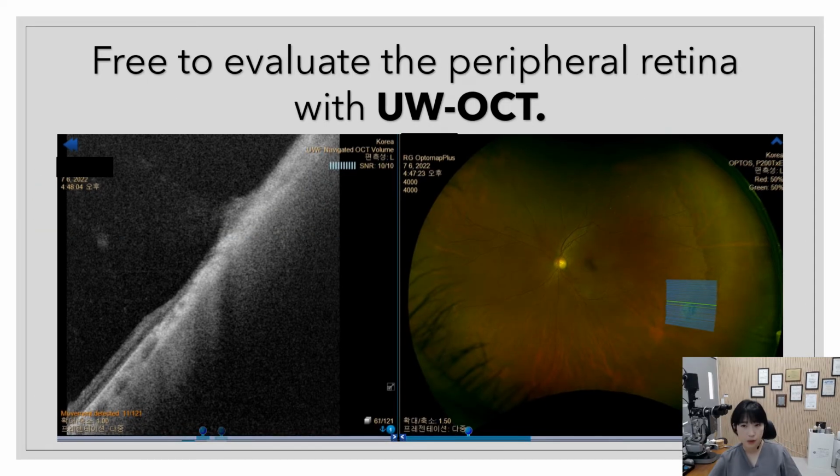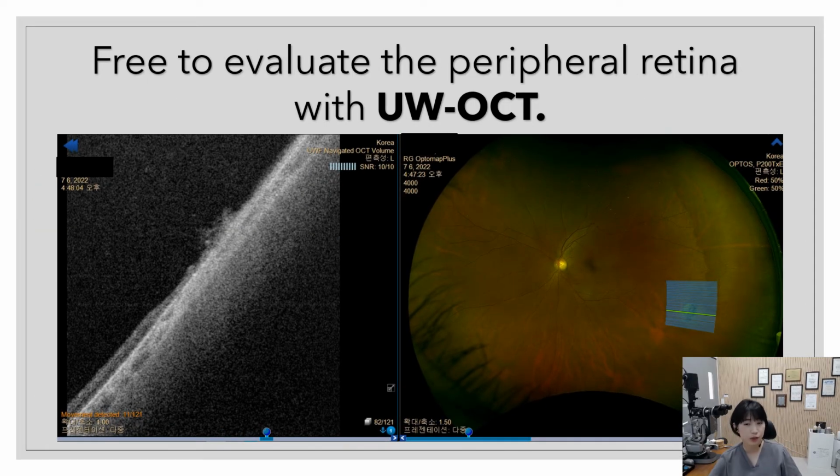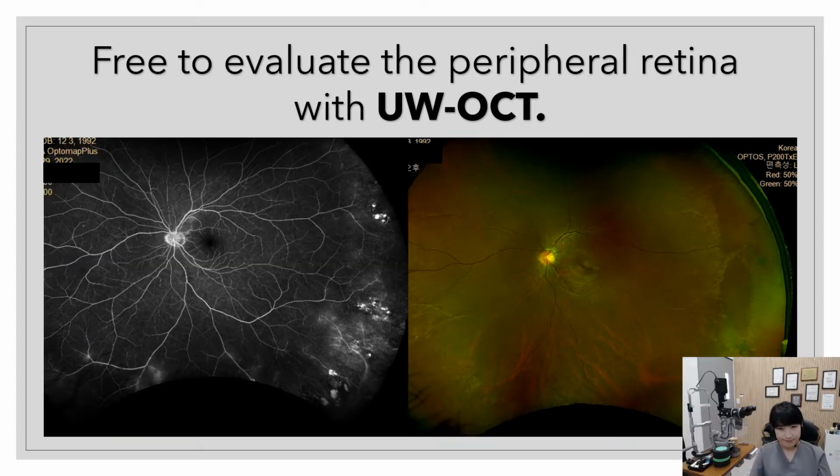With the Silverstone, we are free to navigate the precise anatomic changes in peripheral retina. That includes a deep understanding of vitreoretinal interface diseases in peripheral retina.